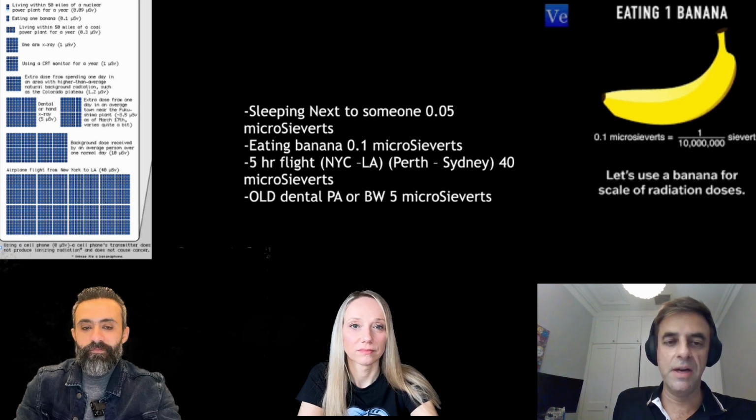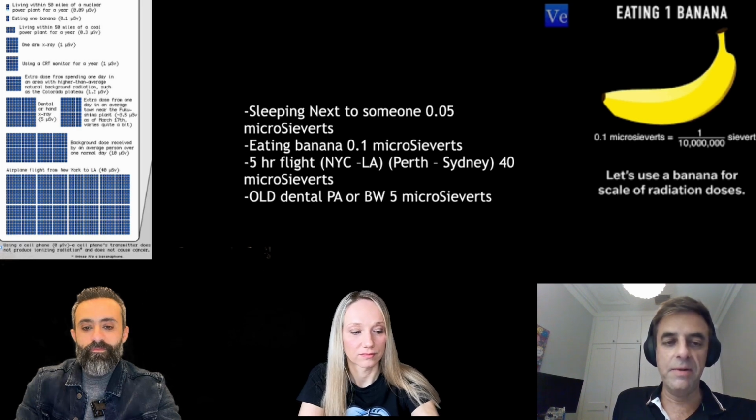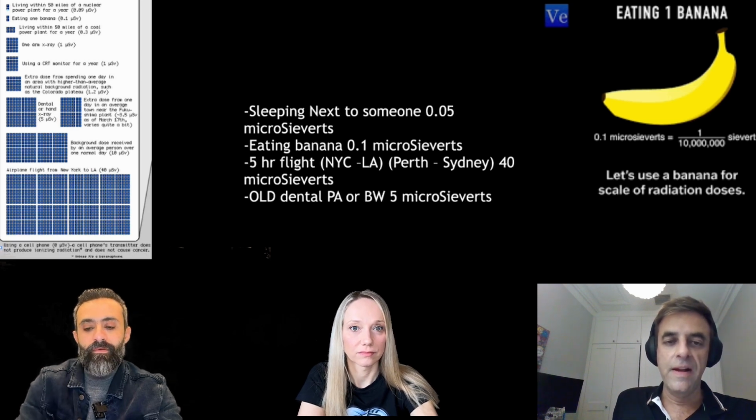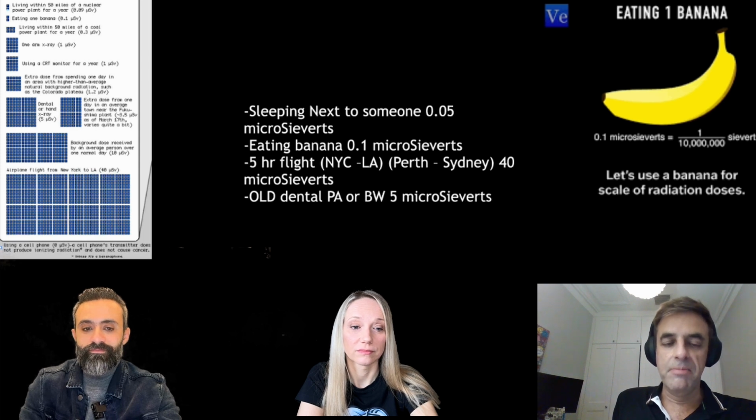For CBCT, obviously, we are looking at higher doses, but the information we get from those doses is significantly better. And to the point where now we sometimes don't need to access a tooth to look and see if it's cracked and things like that. So these are very, very important things that will save the patient time, and also the patient saves a lot of money sometimes with treatments, and also it helps you run your practice more efficiently. So in the long run, these kinds of radiation doses are actually completely okay.